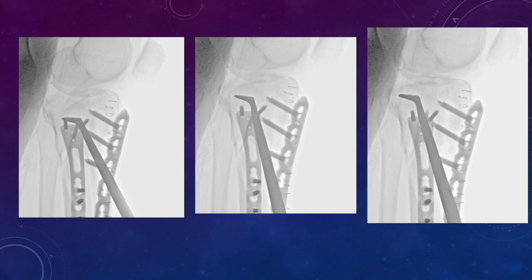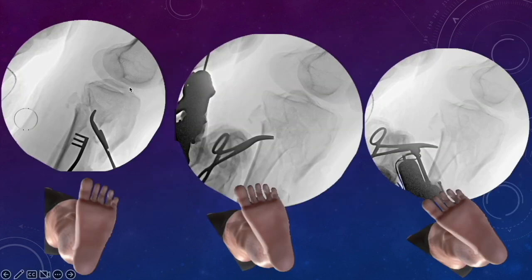So the technique is very simple. I'll show you in the coming slide. This is the kind of view we get when going for a lateral view. There is overlap between the lateral condyle and medial condyle, but often we are confused which one is the lateral condyle, because in depressed fractures we are not sure whether the concavity of the medial condyle and the convexity of the lateral condyle has been maintained or not. Because of the overlap, the things become confusing.